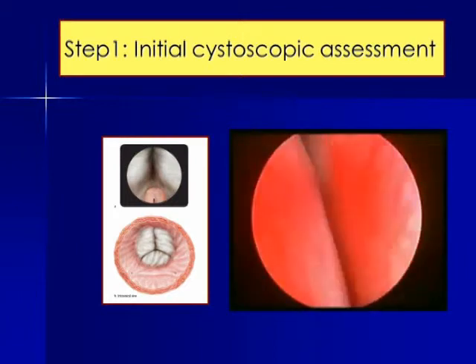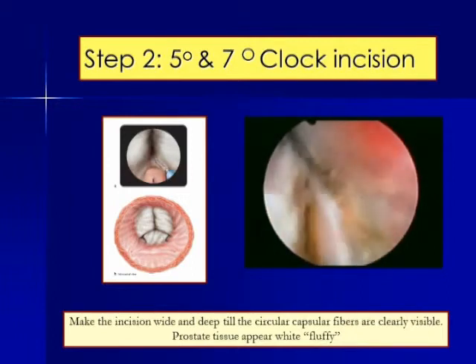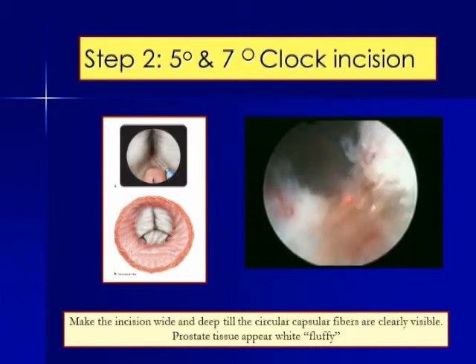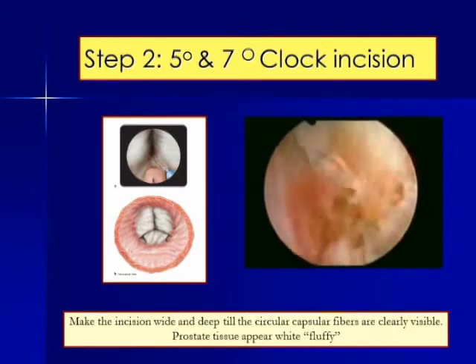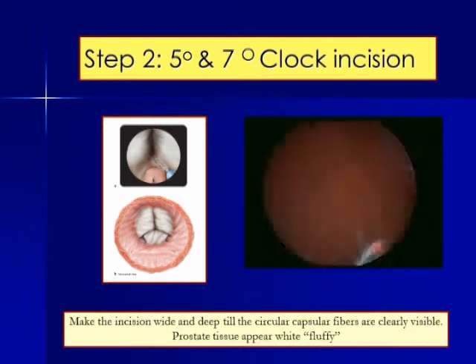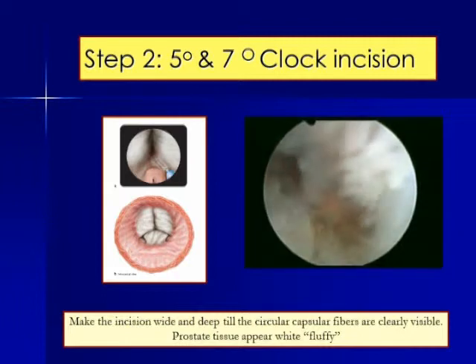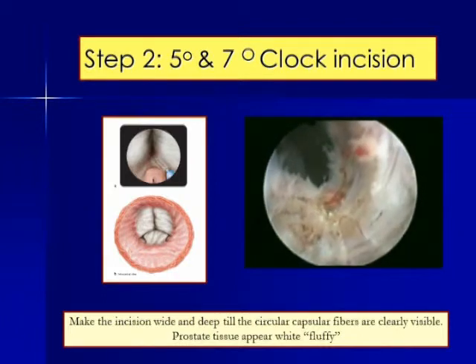In a classical 2 lobe technique, which is normally 3 lobe technique which is recommended, the first incision is at 5 o'clock, which starts from the bladder neck area and it continues down till the verumontanum. It is important that it should be incision deep enough till the capsule. It is very easy to realize and recognize the capsule by its circular fibers.